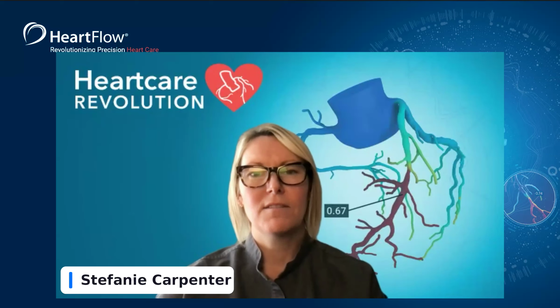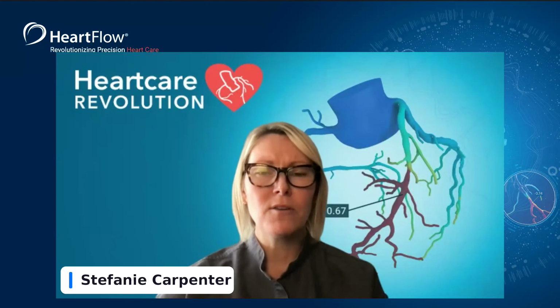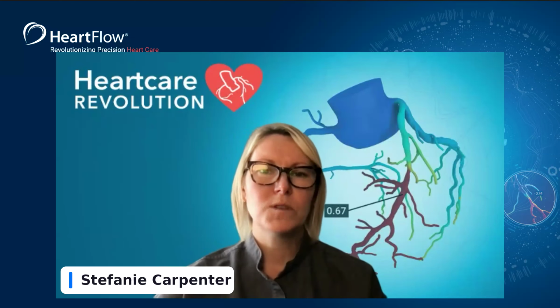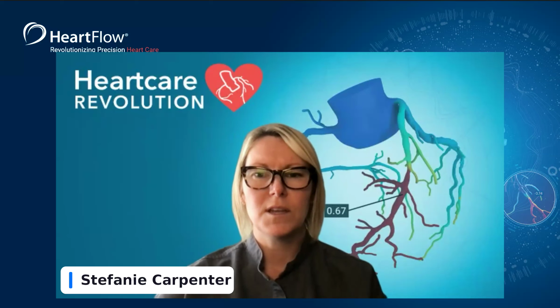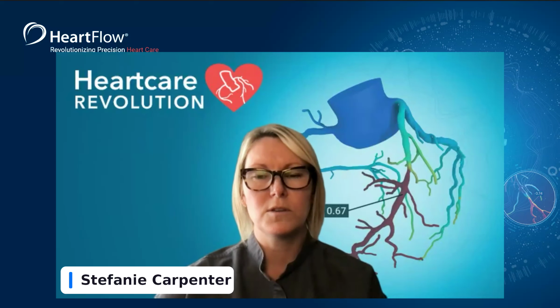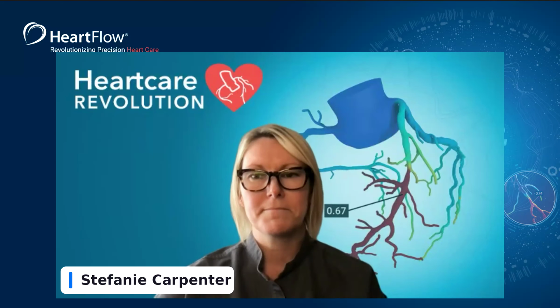So we typically ask for 40 to 80 in 5% intervals. That'll usually give our analyst enough to look through. Just one typically isn't going to be enough. If it's a low steady heart rate, one systolic and one diastolic can usually be okay. But if they're scanning 40 to 80, then my assumption is that their heart rate is on the higher side. So yeah, 40 to 80 in 5% intervals is a good amount of series.